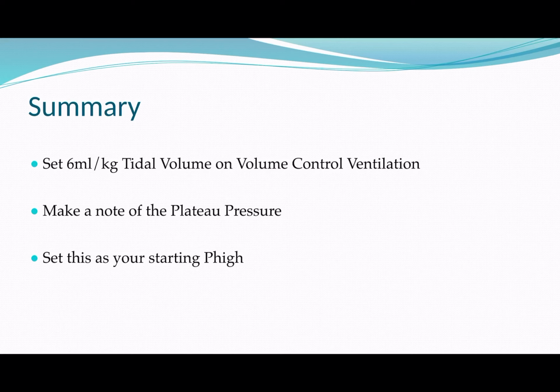And certainly I have seen patients become very unstable when novices have just turned straight onto APRV from a conventional mode of ventilation. Also, if you've got patients with collapsed lobes or even one collapsed lung, what happens with APRV is that you increase the pressure, but if one side is collapsed due to sputum plugging and isn't seeing any of that increased pressure, all of it is going on to the opposite good lung.